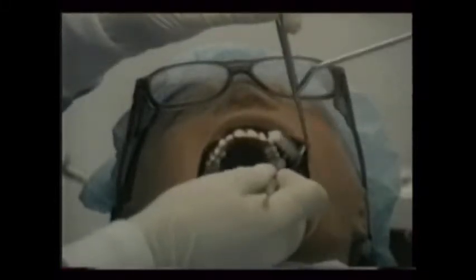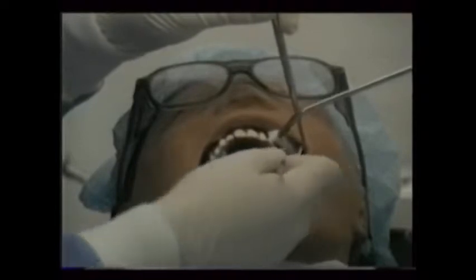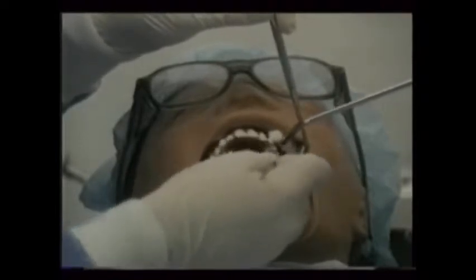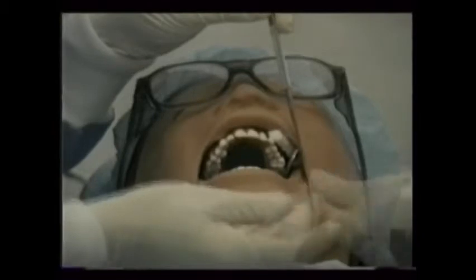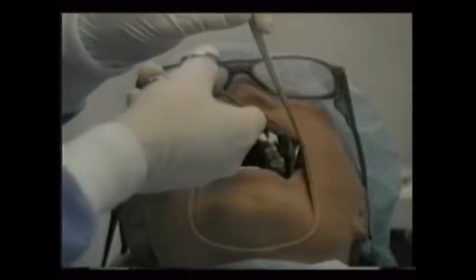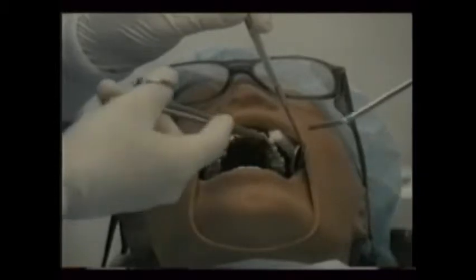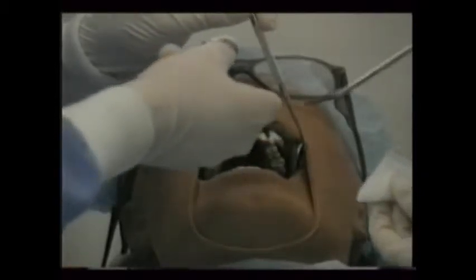Next, the gums are carefully reflected from the teeth and the underlying bone using a periosteal elevator. The doctor then exchanges the elevator for tissue forceps and tissue scissors or nippers. As the doctor trims the diseased tissue away, hold several layers of gauze near the treatment area to help wipe the instruments clean. Throughout the procedure, keep the surgical aspirator tip near the treatment area to maintain good visibility and to retrieve small pieces of diseased tissue.